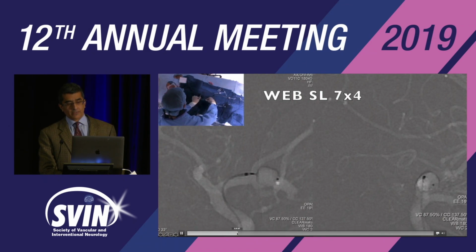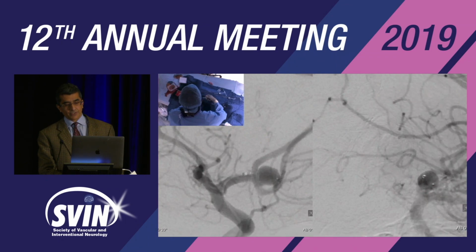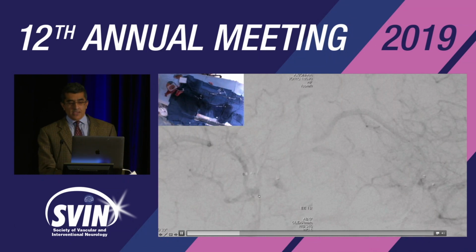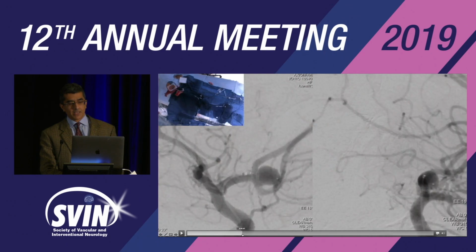Device is deployed, not detached. We do an angiogram, and we can see that it is covering the neck of the aneurysm. We were concerned a little bit at the bottom aspect, but again, as I said, once the microcatheter comes out, the device will tend to settle down a little bit because of the curvature in the anterior cerebral artery. The pseudoaneurysm component is already not filling.